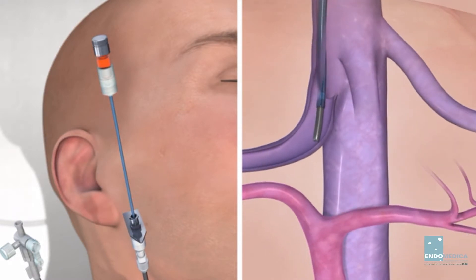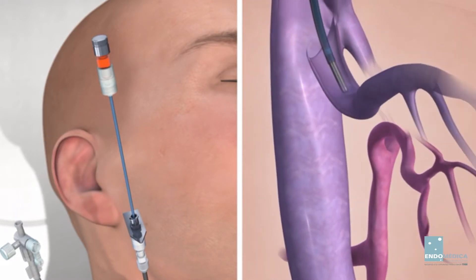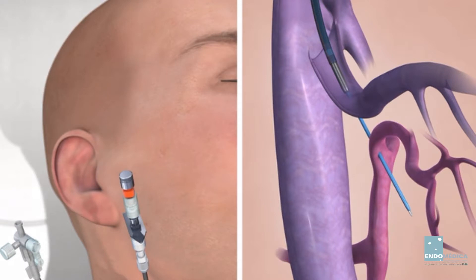Wedge the catheter and cannula assembly against the vein wall. Thrust the 5 French catheter and stylet assembly in one movement forward through the hepatic parenchyma and toward the portal system.